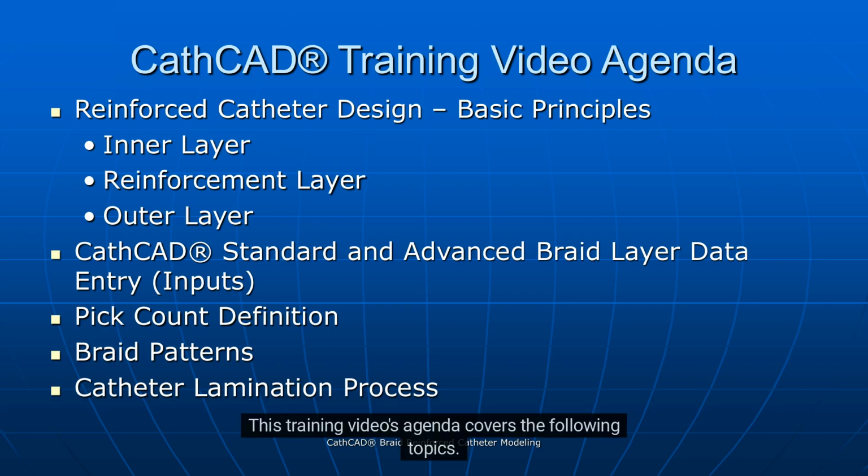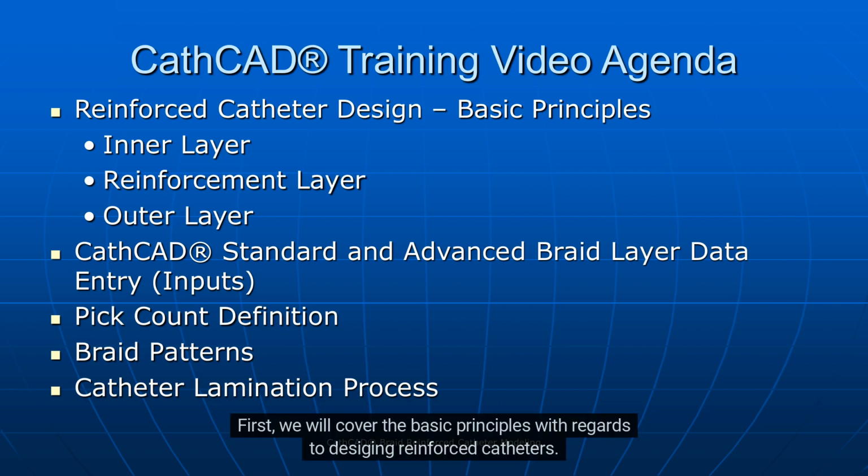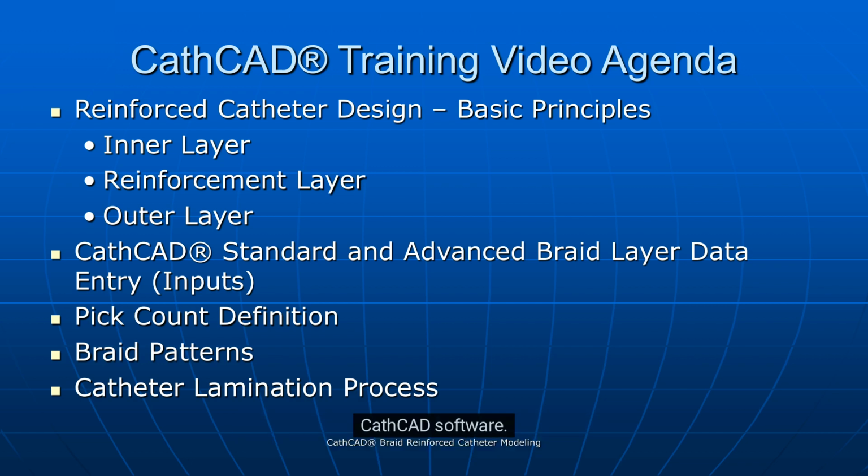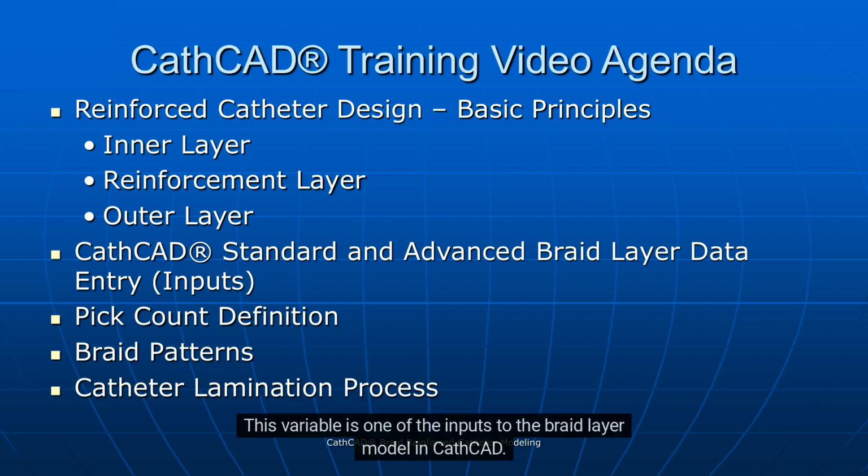This training video's agenda covers the following topics. First, we will cover the basic principles with regards to designing reinforced catheters. Second, we will teach the user about required data entry inputs for entering the braid layer into the CathCAD software. Third, we will define the term pick count. This variable is one of the inputs to the braid layer model in CathCAD. It is commonly used in the medical device industry.